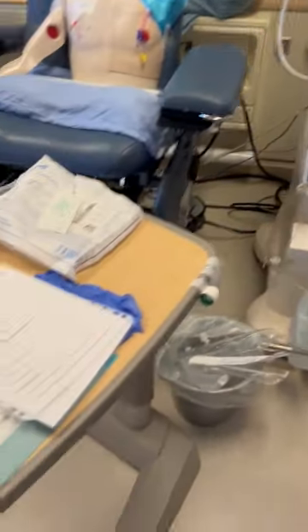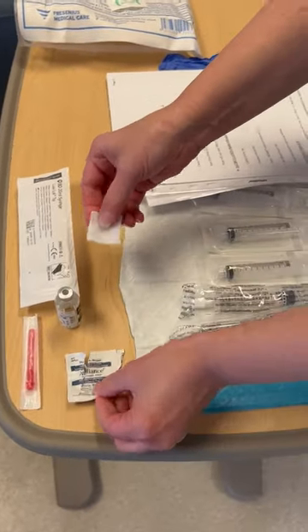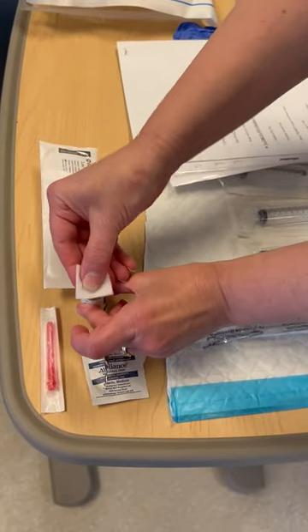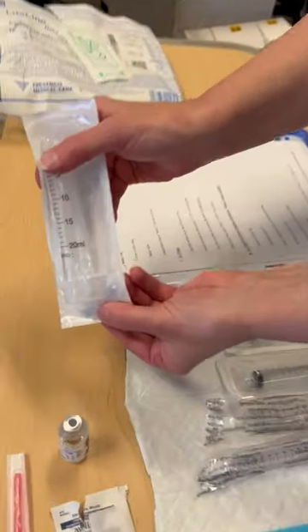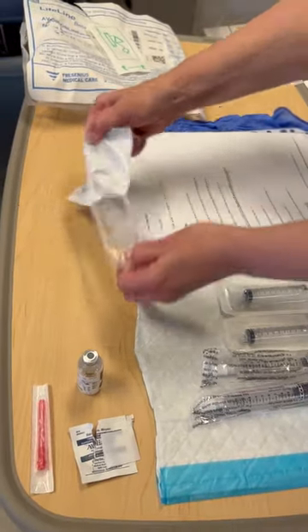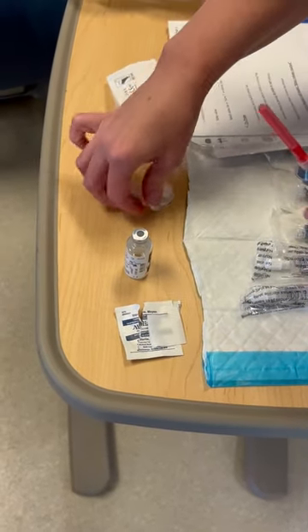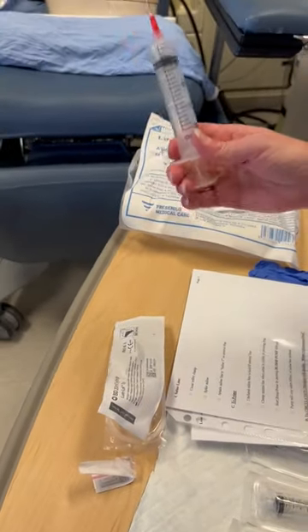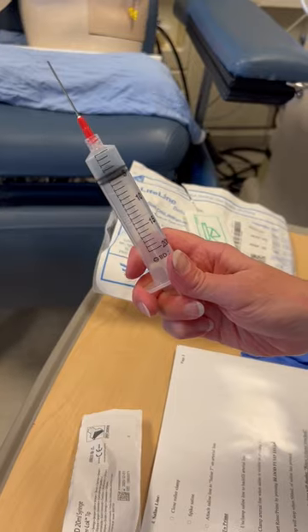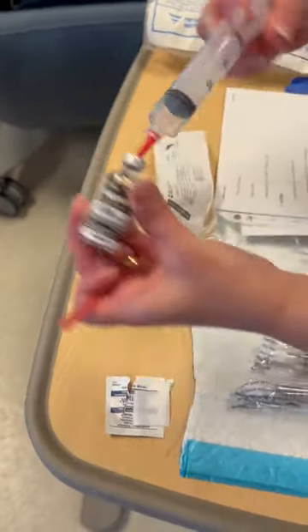While the machine is priming, we can go ahead and draw up our heparin. Since this is an open vial, we're going to swab the top with an alcohol swab. We're going to get a 20 ml syringe and attach a blunt tip needle. To make sure the heparin comes out, it's always good to put in the exact amount of air that you're withdrawing heparin for your prescribed dose.